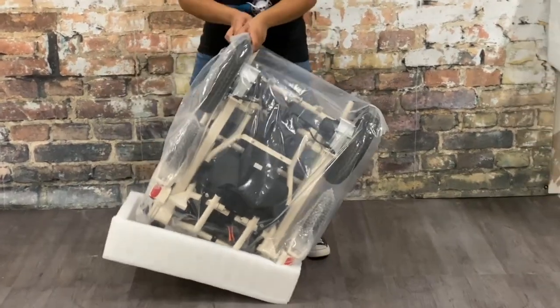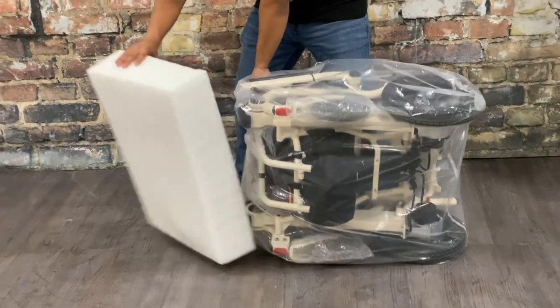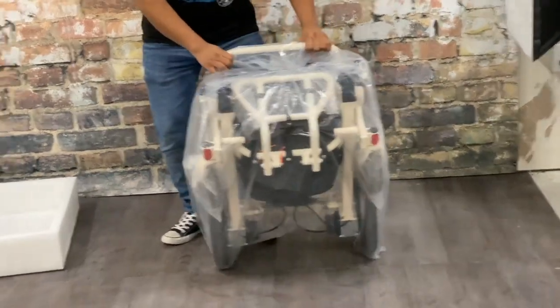Now that the chair is upside down, we're going to continue our cartwheel — lay the chair on its side, slide out the foam top, and continue to do another cartwheel to get the chair back upright.